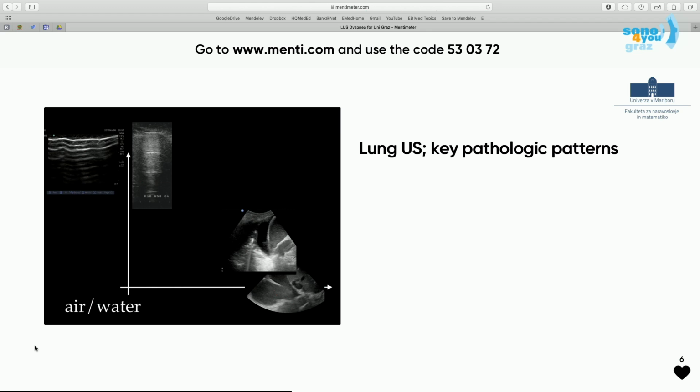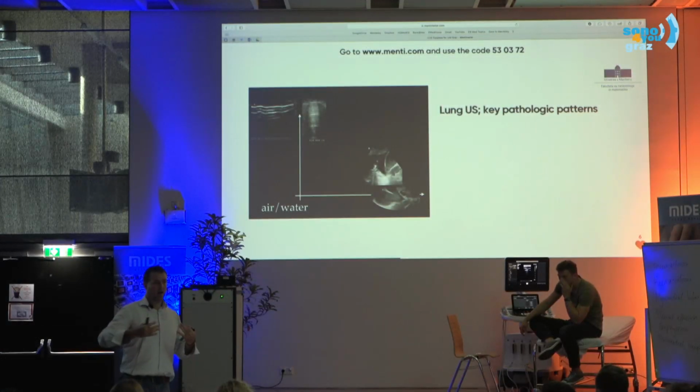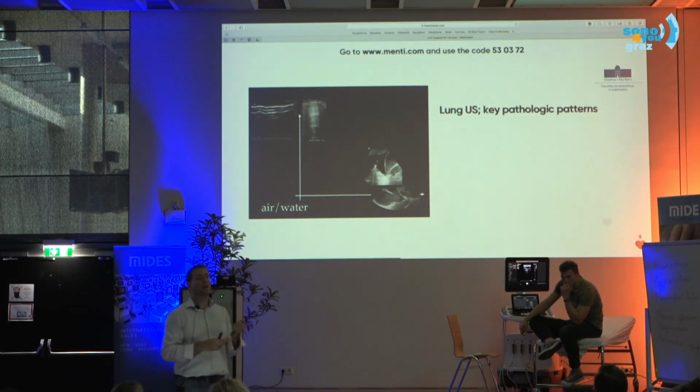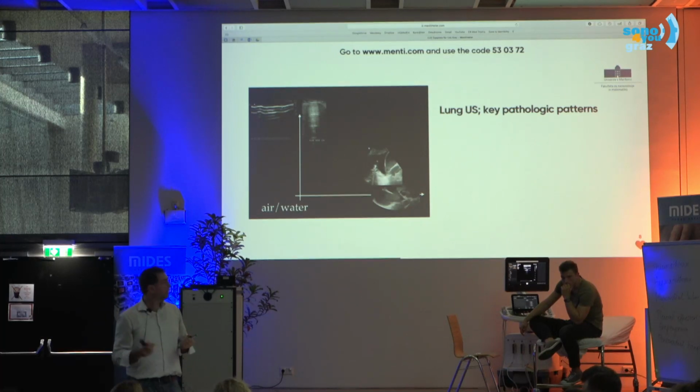You know how water looks on ultrasound? How does it look? It's completely anechogenic, right? Ultrasound goes through. So on the ultrasound screen, it looks black, agree?